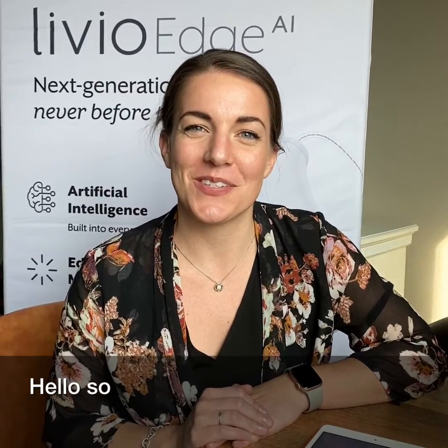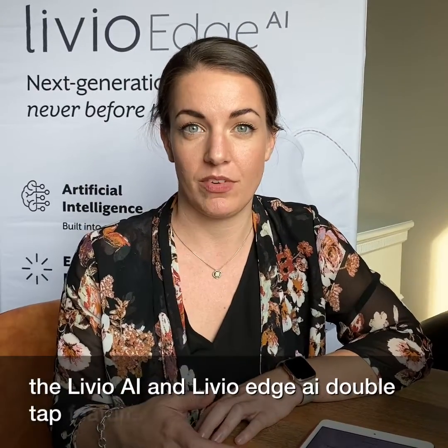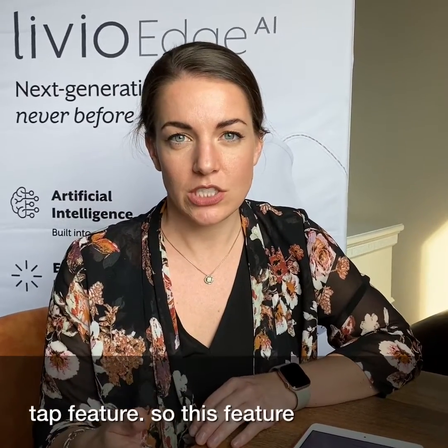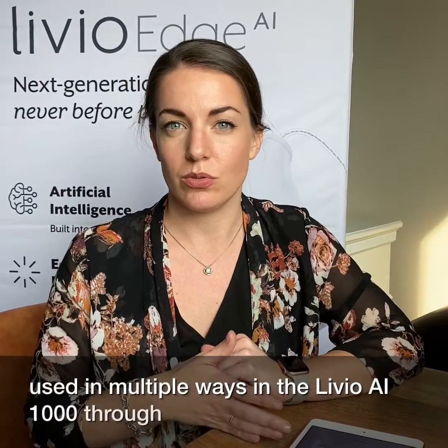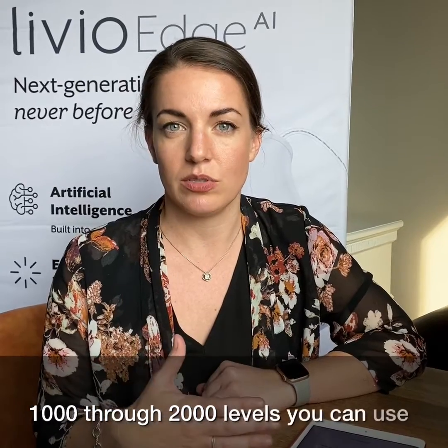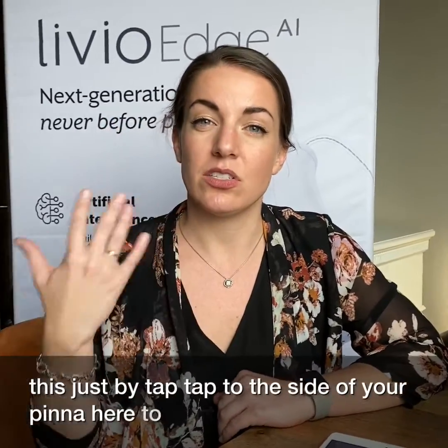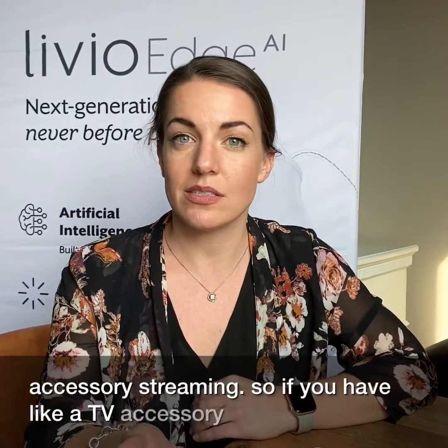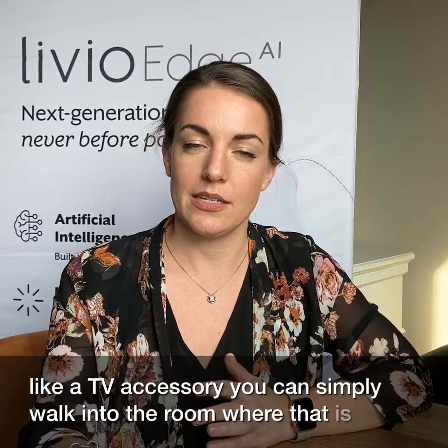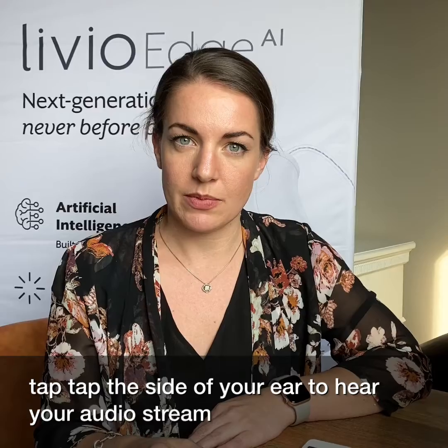Hello! Today I want to talk about the Livio AI and Livio Edge AI double tap feature. This feature can be used in multiple ways in our Livio AI 1000 through 2000 levels. You can use it by simply tapping twice to the side of your pinna to start and stop accessory streaming. So if you have a TV accessory, you can walk into the room and tap tap the side of your ear to hear your audio stream to your TV.